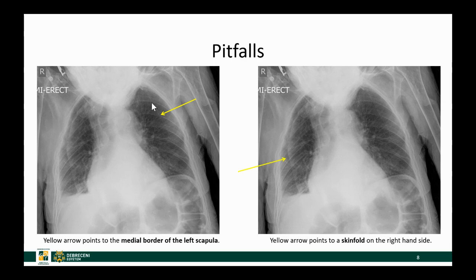This patient also has another white line over the right lung. This white line kind of mimics the contour of the right lung; however, beyond it there are also lung markings, so this cannot be the sign of a pneumothorax. We see these lines quite frequently when elderly people or very young children are imaged, especially if supine or semi-erect. This white line is due to a skin fold.